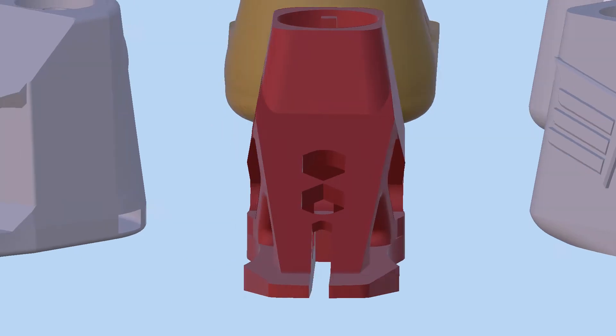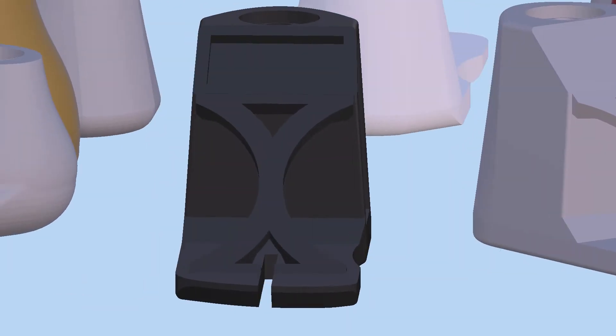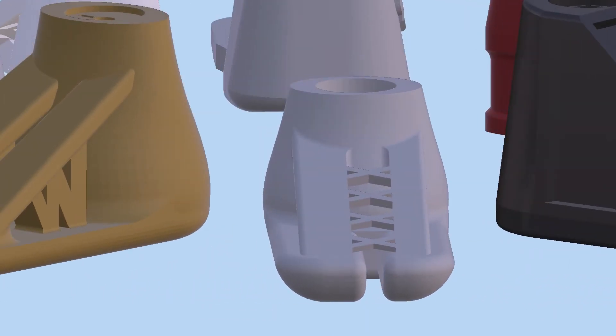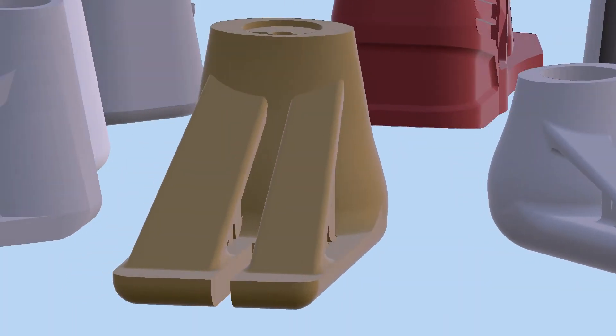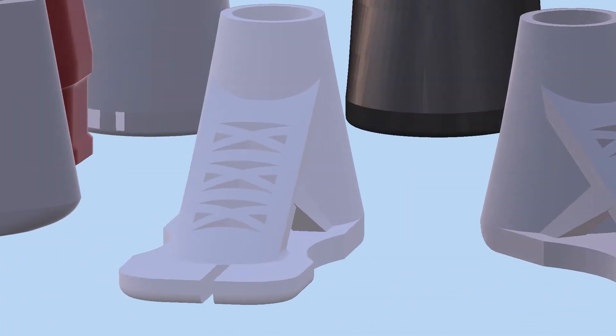Over the course of the design process, the prosthetic models underwent numerous changes including tolerancing and dimensional adjustment, material reduction while maintaining strength to weight efficiency, flexibility to allow for improved deflection, and integration of a NinjaFlex shock absorber.